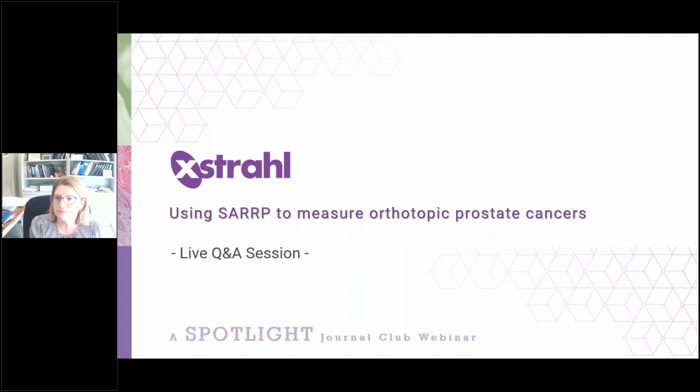But I think that you could use this technique in a lot of different tumor sites. And if, like in the pancreas, where you really don't have good CT visualization of that organ, you can use those fiducial markers, and that can help you as well. So I think there's ways to get around it.